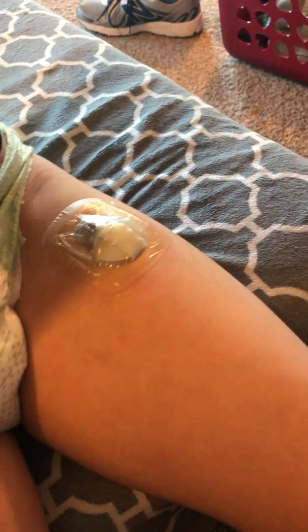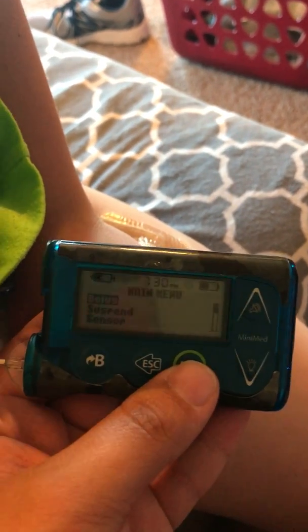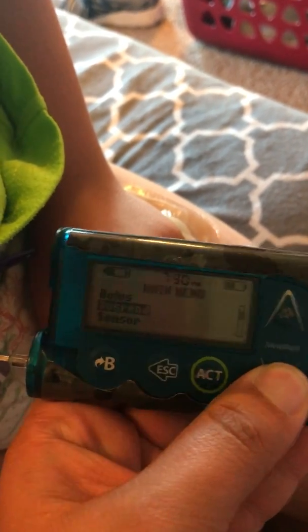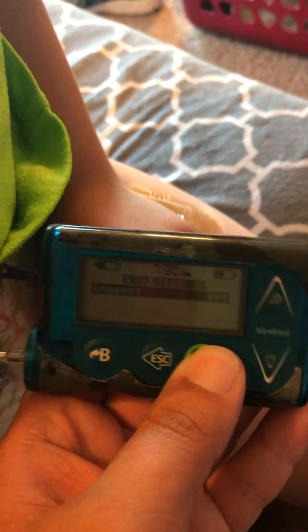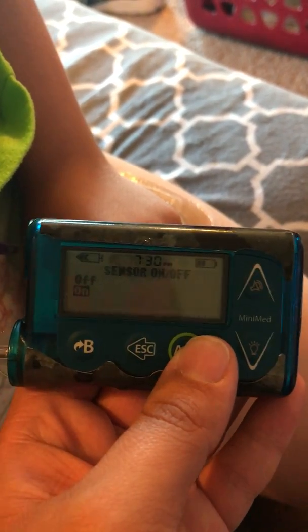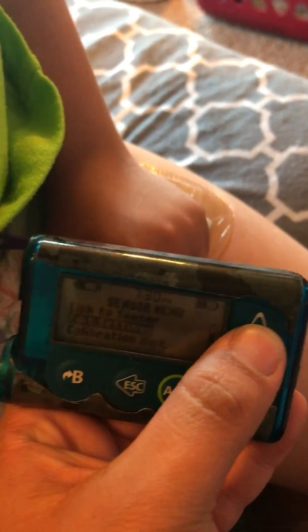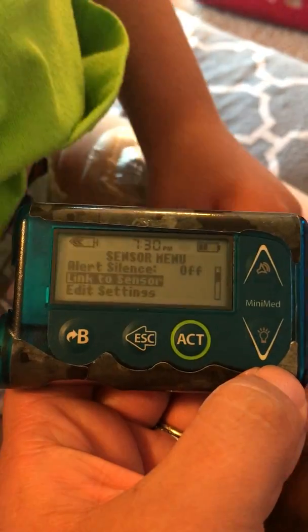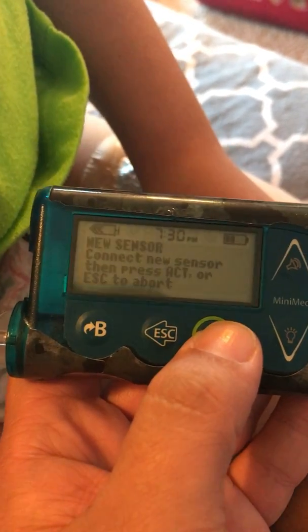Now the only thing that you also have to remember to do, and we've forgotten to do this, is you have to get out his pump. When you go in, you're going to push Act. You are going to go down to Sensor and push Act again. Edit settings, Act, Sensor, Act, and you're going to turn this on. And you'll escape once because you're going to go to Link to Sensor and Act, and you're going to do a new sensor. So hit Act.